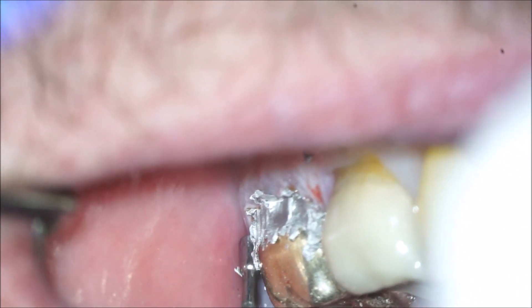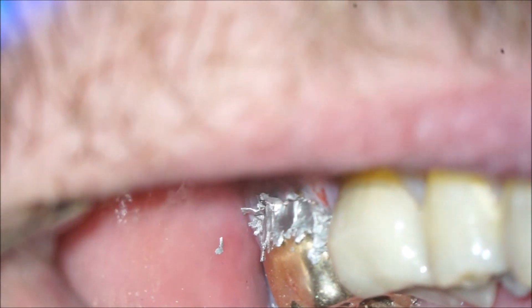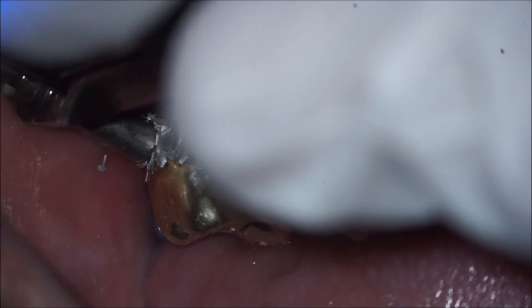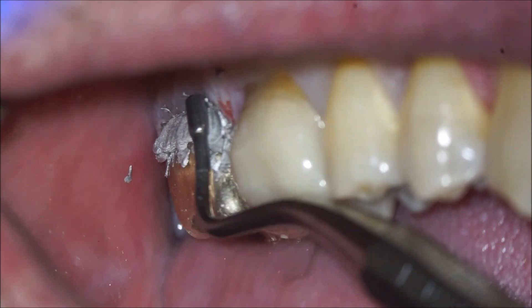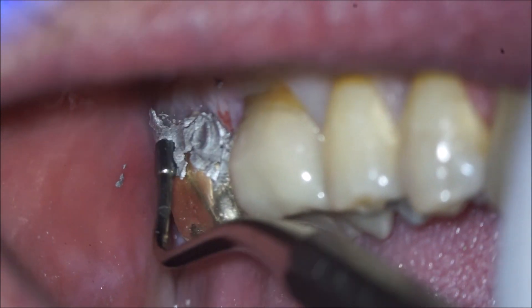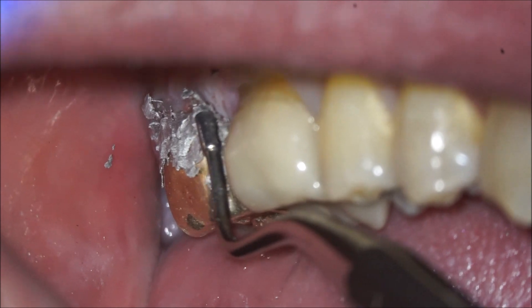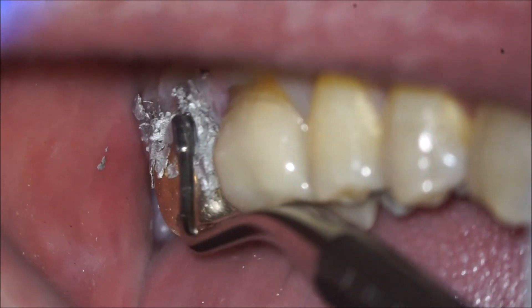We're just trying to condense this really nicely, get it slightly overfilled, and make sure it's in every little nook and cranny of the cavity preparation. Coming back with one final increment — we're already completely filled, but I want to overfill this to make sure there are no voids or areas left out. Condense this well, and the side of your condenser works well to keep you from digging into it. Really try to drive it into the mesial there. Then once that's done, you can use the side of the packer to start burnishing and removing some of the bulk of material.